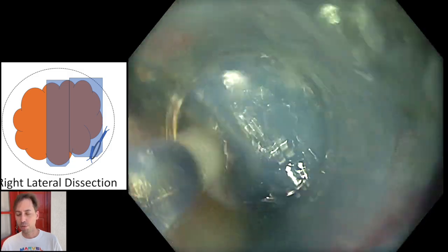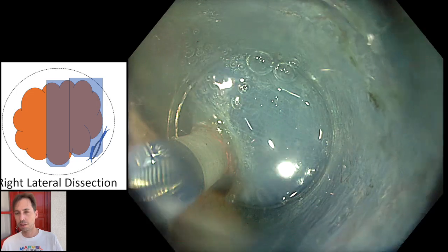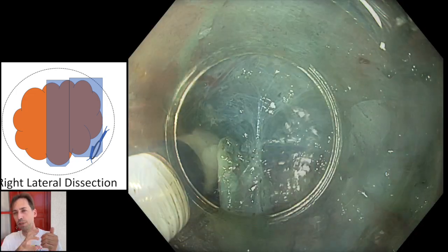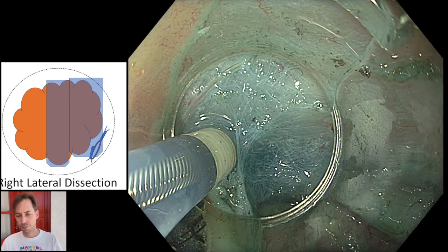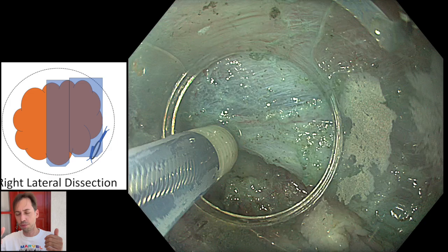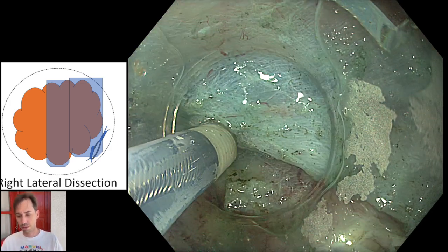and we move only up-down, and we try to avoid using our right hand to turn the wheels. So we rotate the shaft of the scope with the right hand, and we use up-down with the left hand. It's like driving.